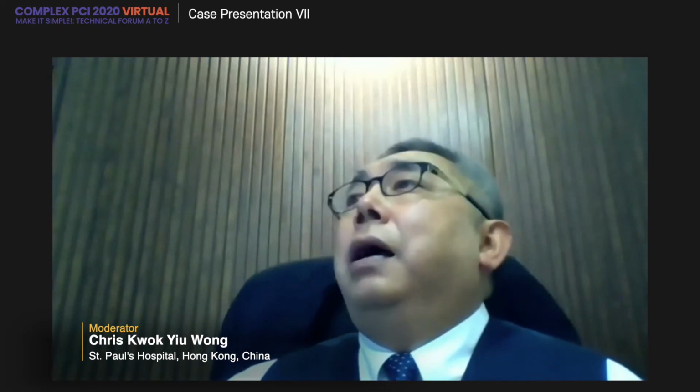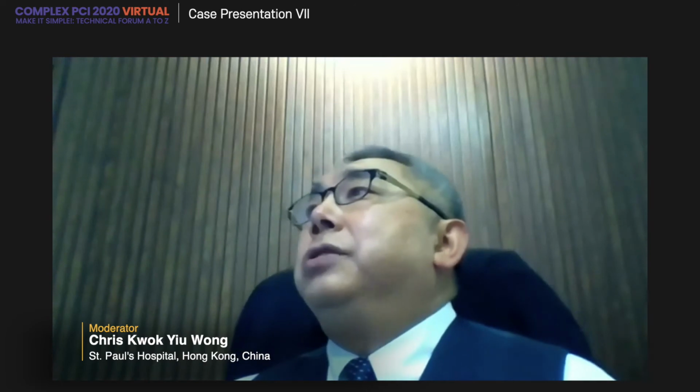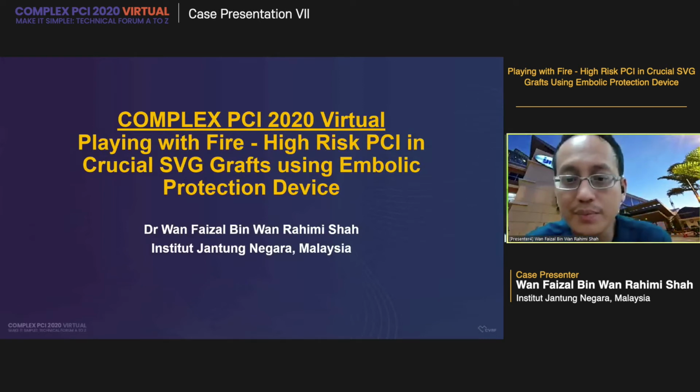So we're coming to the next case, playing with fire, high-risk PCI in crucial SVG grafts using embolic protection devices, by Dr. Shah from Malaysia. Dr. Shah? Okay, good day, everyone. My name is Dr. Wan Faizal Rahimi Shah from Malaysia.